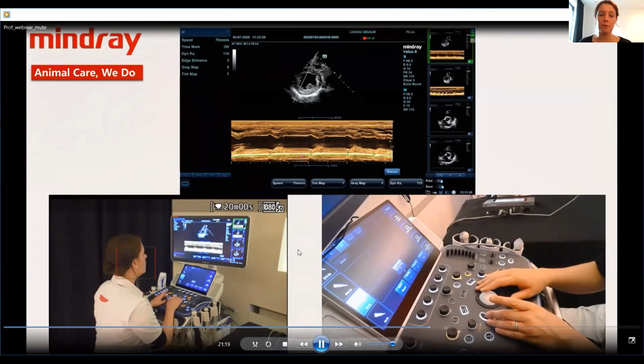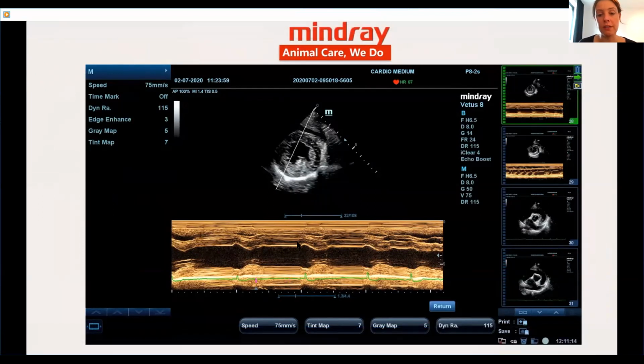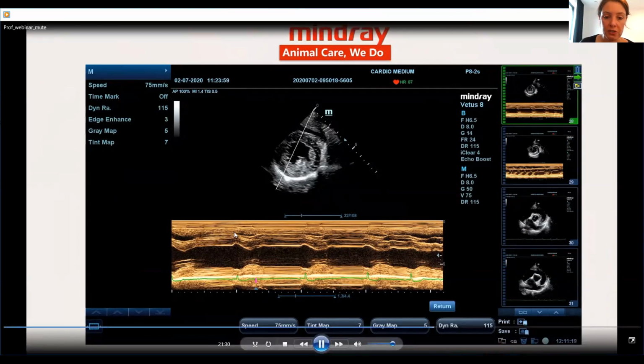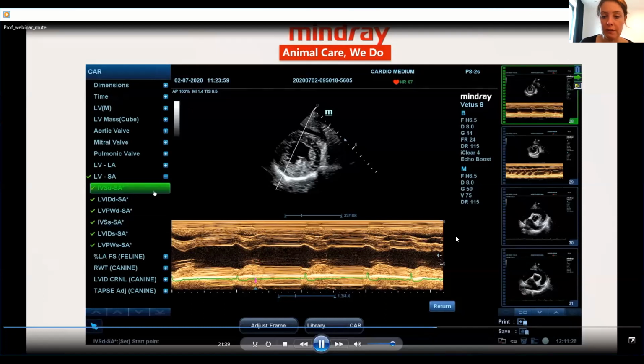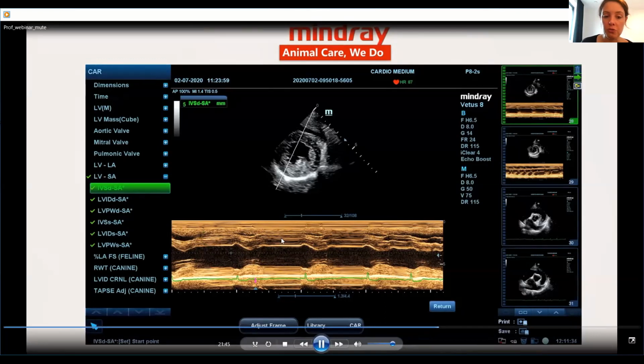Most people, when you start, you will start with the M-mode image here in the short axis view. So what we want to measure is actually the wall thickness and the diameters. Often it is a bit challenging to have a good resolution here of the right ventricle. So I don't standardly measure the right ventricle in this view. Usually I focus on the left ventricle. It's of course different when you have dogs with a right-sided problem, then of course we will do it. But I advise you to start with the left ventricular measurements from this side.